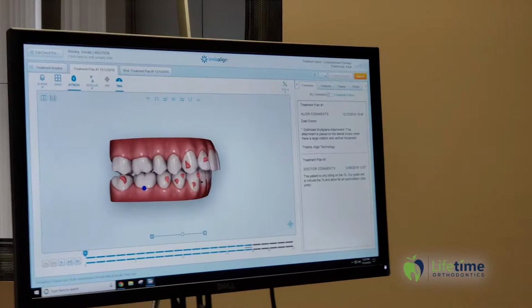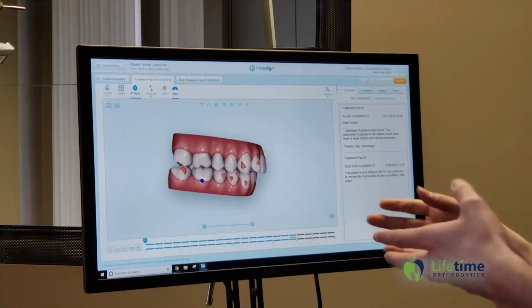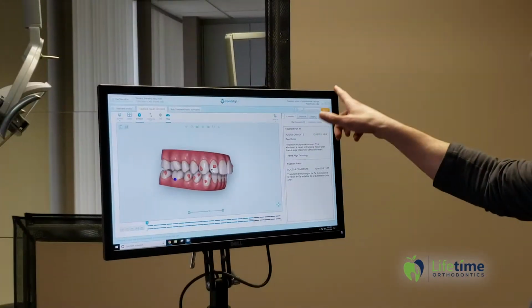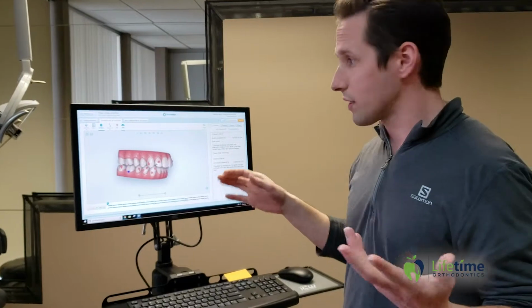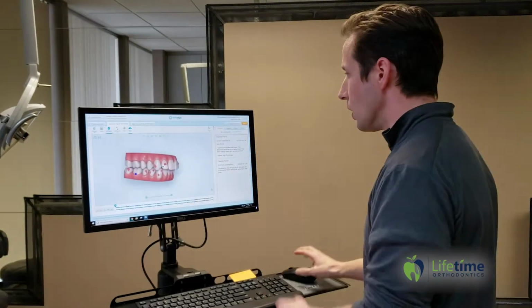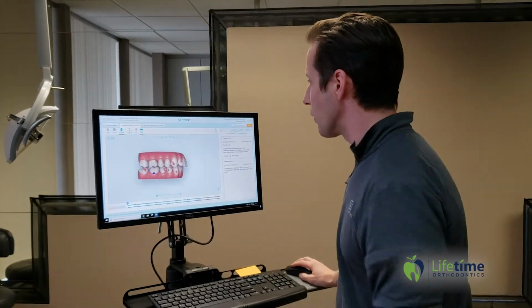And so when I get this back, we always look at it, and we first look at the bite. Is the bite set correctly? Because I'm counting on some technician who's not an orthodontist to set the bite. And so very rarely do we ever just hit approve and accept the trays. I mean, this is treatment plan 1. On average, I have treatment plan 4, 5, and 6 before I'm happy with how your case, or probably how my case, will come out. So first of all, I look at this bite. I know my bite because I live with it. I overanalyze myself every day, so I know this to be accurate.